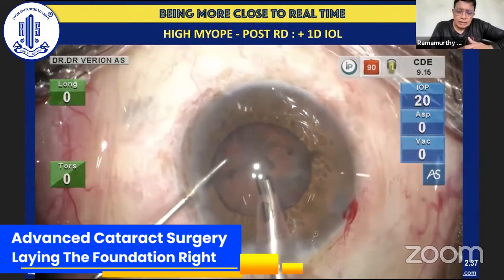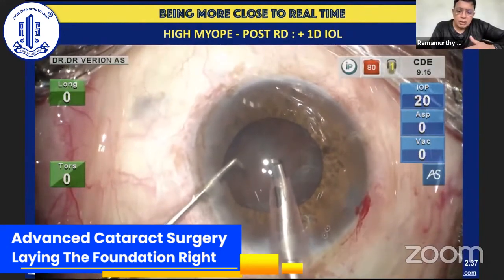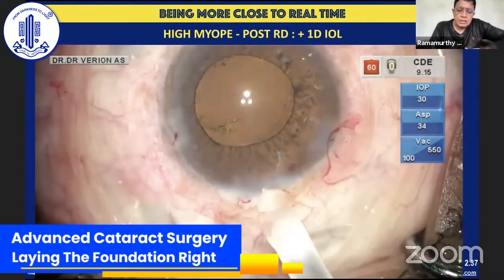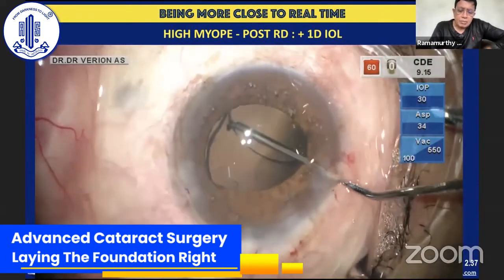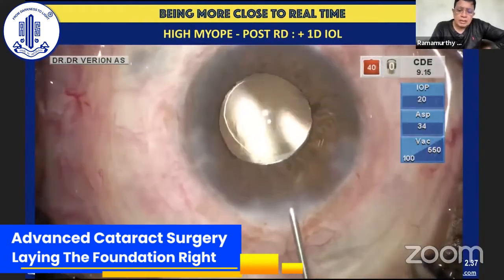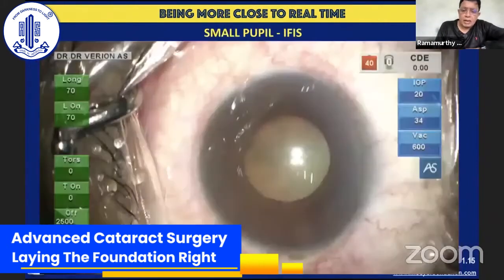And that's the nucleus fragment that has been completely removed. The CDE is about 9. That's less of an issue, but you could see the stability of the cornea and the anterior chamber during the entire procedure. Now you can see that buckle, which was implanted almost 20 years back, and a 3-piece +1 diopter intraocular lens is being injected with a good uniform rhexis overlap. And in this case, the Active Sentry has been actuated just once. Obviously, even this is important, adding a further safety level over the active fluidics that we are all becoming quite familiar with.